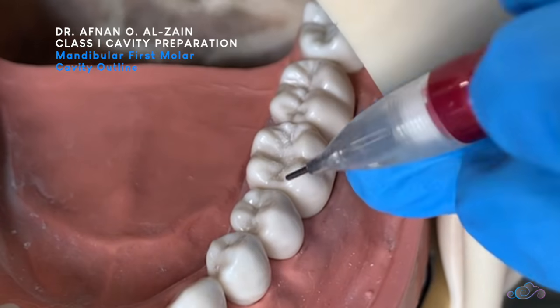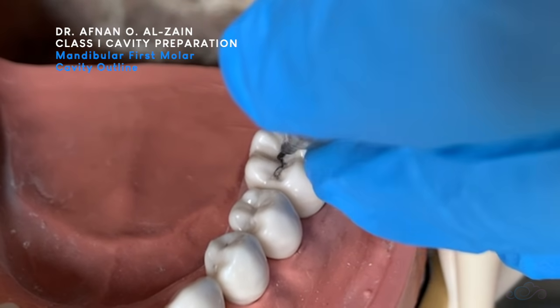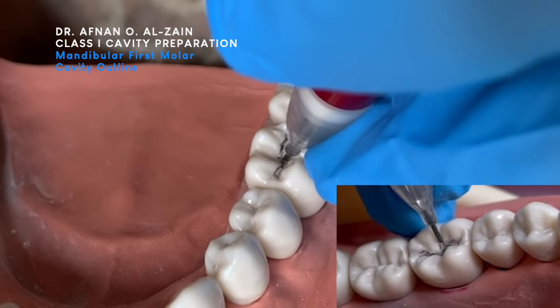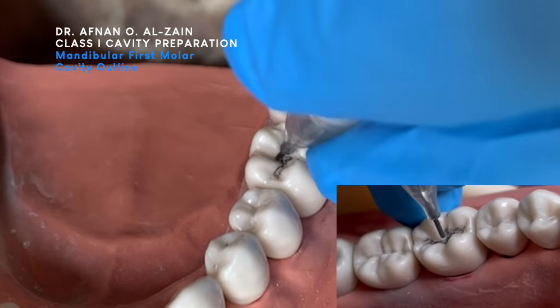First we will show the outline. We will move from the proximal triangular fossa to the other proximal triangular fossa. Then we will move into the buccal groove, half of the distance. We will not reach the cusps so that we do not overextend the cavity and weaken the cusps.